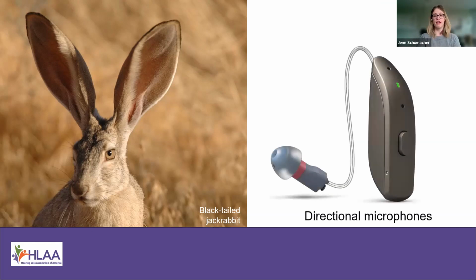So if we take a picture of a hearing aid here, and this is the hearing aid from the back, this little gray part with a dome on the end, that's what actually goes and sits inside your ear. That's the loudspeaker that plays the sound. But before it can play any sound, it first has to collect all the sounds happening in the environment so that then the software inside the hearing aid can process it, amplify it appropriately for your specific hearing abilities, and then send it through the loudspeaker. So the microphones are like the first piece of the puzzle.